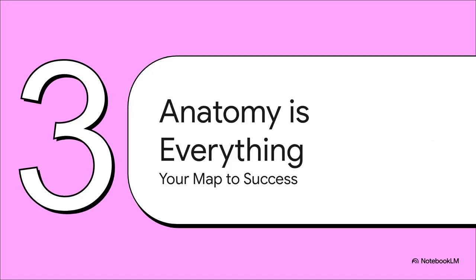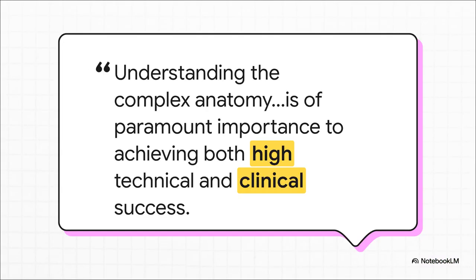So if we decide to go the obliteration route, we can't just dive in blind. I mean it. Success is almost entirely dependent on understanding the patient's specific and often super complex vascular anatomy. It's all about the map. And you don't have to take my word for it. This quote really says it all. You have to know the map before you start the journey. So that pre-procedural imaging, usually a CT angiogram, isn't just helpful, it's absolutely essential. It's how you plan your approach and, honestly, how you avoid failure.